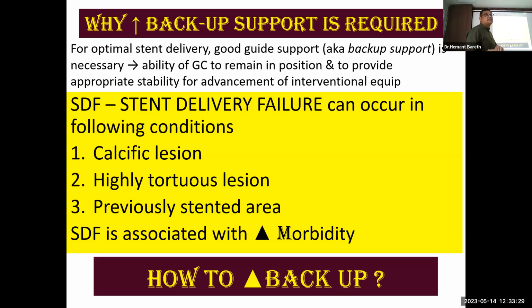But the thing is that backup is not good enough because it's not made of 3 layers. So backup is much better in a guide. But many a times you require even more backup for doing the procedure. And it is important to keep the guide catheter in position so that it doesn't keep coming out of the ostium again and again. And it provides appropriate stability for advancement of interventional equipment.